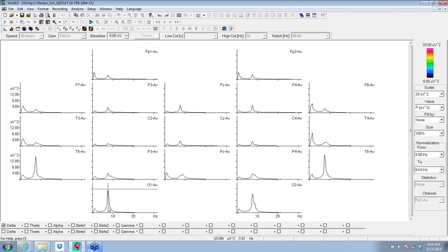The databases would start to call these theta, and it would tell you there's too much theta. And when things are tuned so it's outside of the expected range, you're going to get some really strange things in the database. If this alpha just nudges up into the alpha range, it'll end up having a lot of the coherence and everything suddenly declared much more normal by the databases. But you can see we've got slow alpha in the temporal lobes. The overall alpha peak is slow. And for age 70, this is too slow.